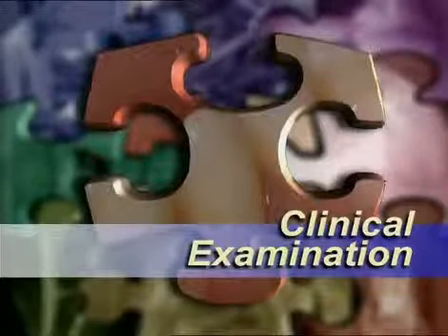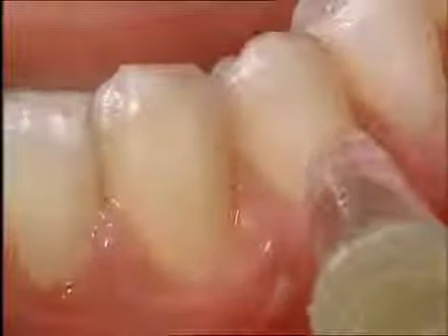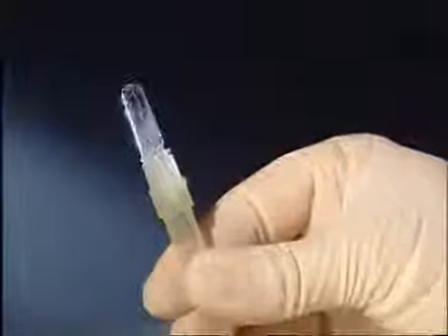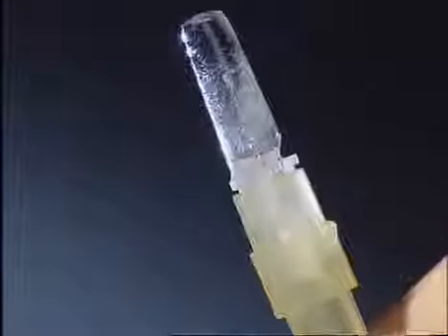In the clinical examination, we have to reproduce the patient's symptoms. First, all teeth on the painful side of the patient's mouth are checked thoroughly and tested for vitality. Responses to cold are within normal limits in this case.